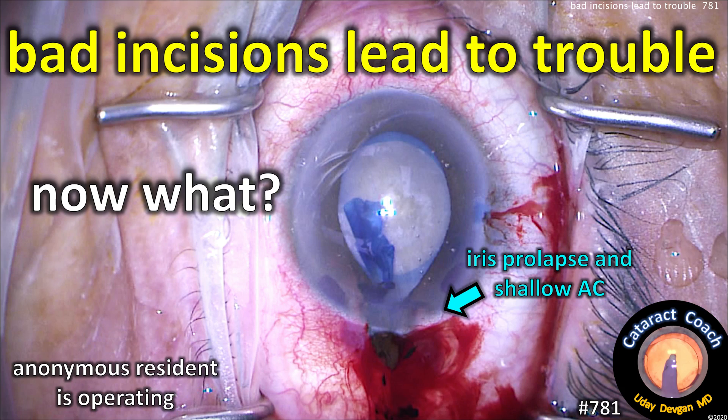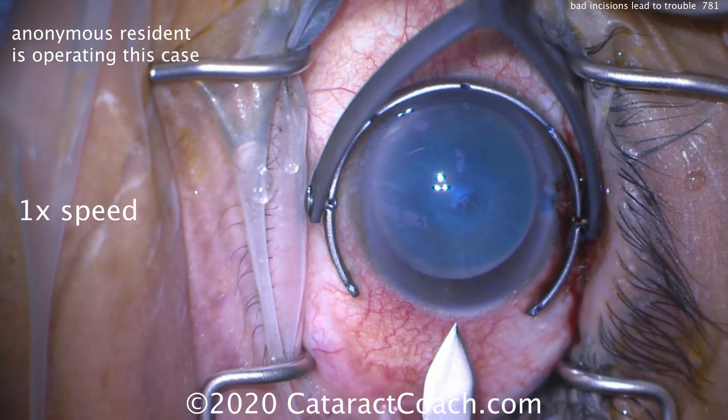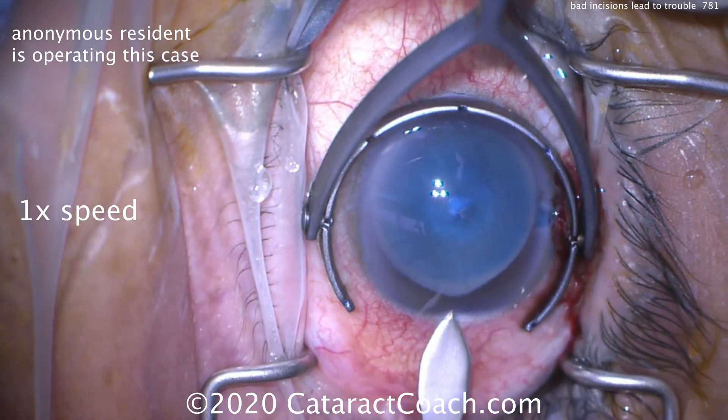CataractCoach.com. Bad incisions lead to trouble. Now what? We've got an anonymous resident who's operating and sharing this case with us. Here comes the incision — watch carefully. It's a little too peripheral, so you get a little bit of conjunctival bleeding.